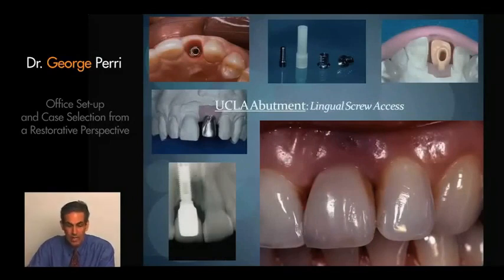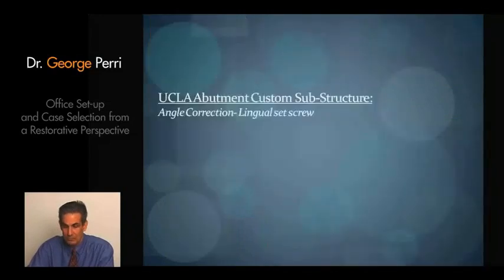I can show you literally hundreds of cases where we don't have that issue, but I think we need to understand biologically what is going on in those areas. And certainly I could make an argument where there's an advantage to having an all-ceramic abutment screwed directly to the implant, and then an all-ceramic restoration cemented over the top, as perhaps having biologically more potential. My only issue there is the level of the cement line.